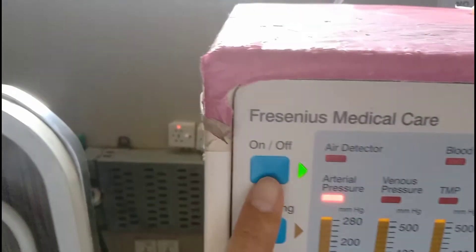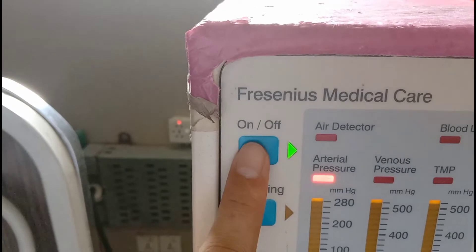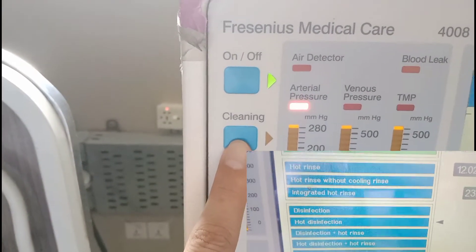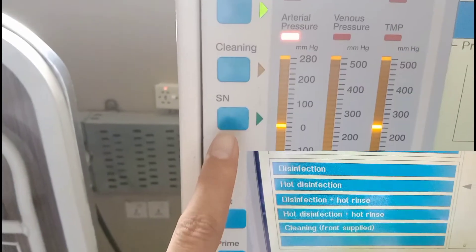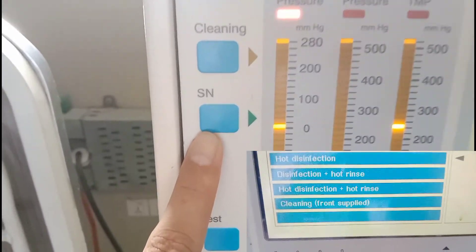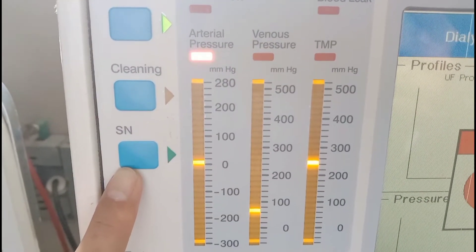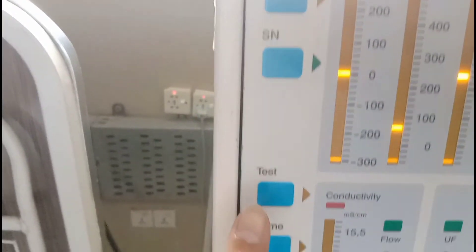Below the on and off button there is an option for cleaning — you can put the machine on different cleaning options that are shown on the screen. Before the cleaning button there is a single needle button that is used for single needle dialysis.